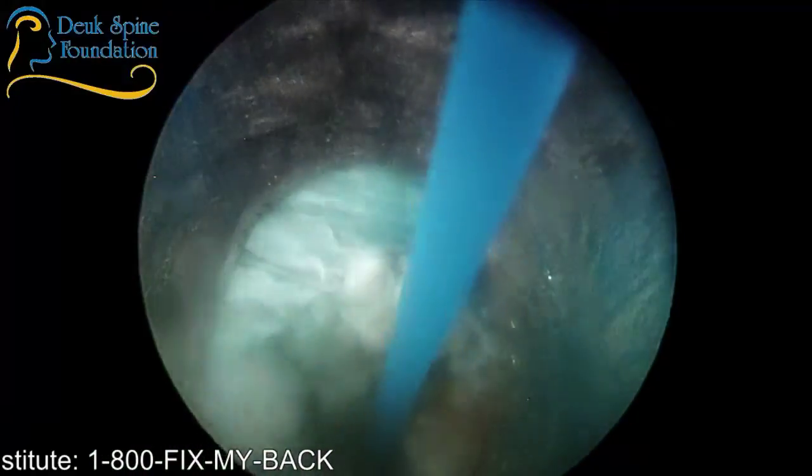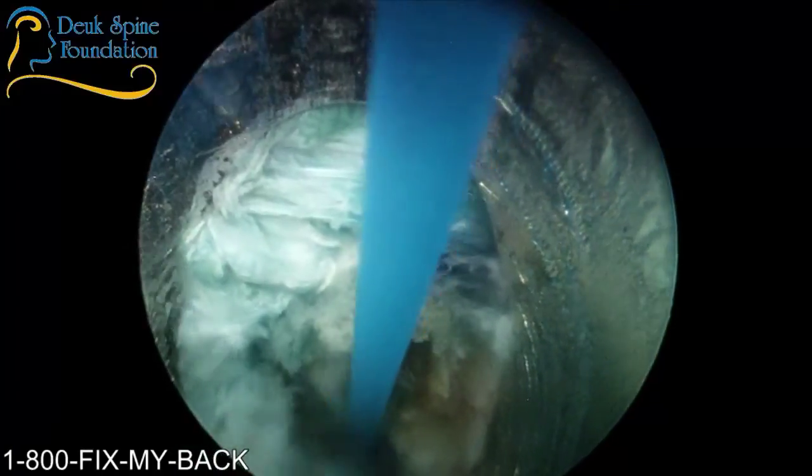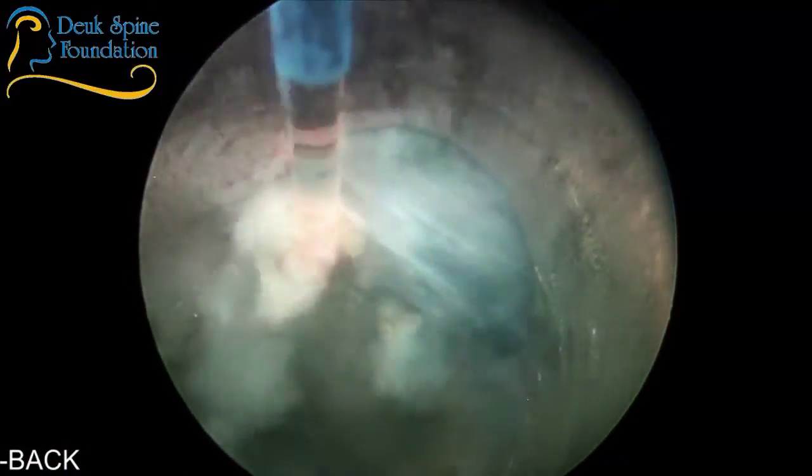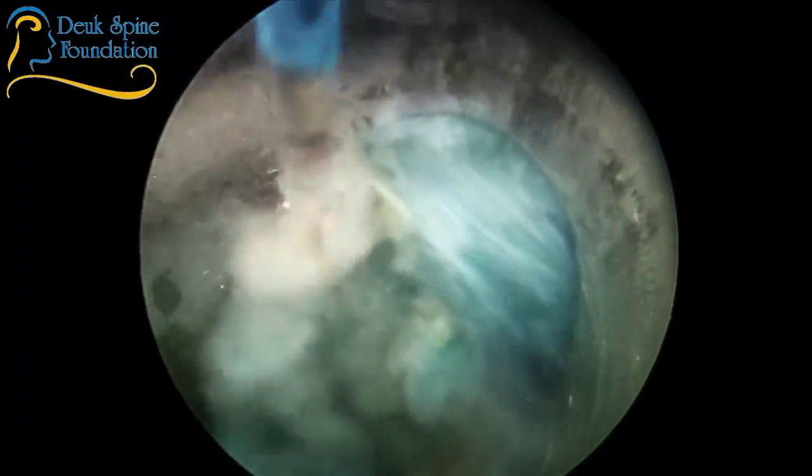All right. Oh yeah, this is it right here. You can see the epidural fat right up there at 12, which is now at 2.